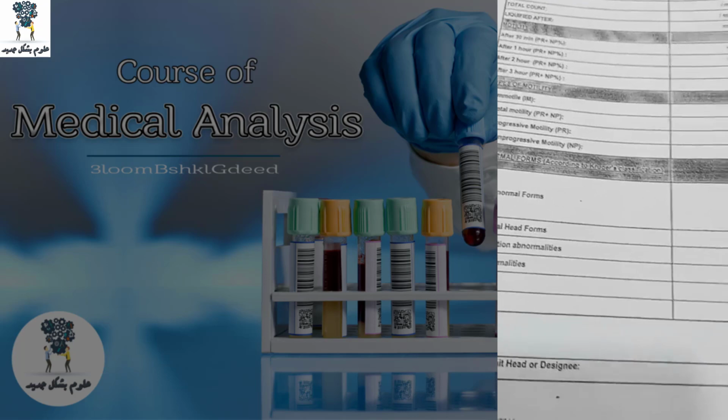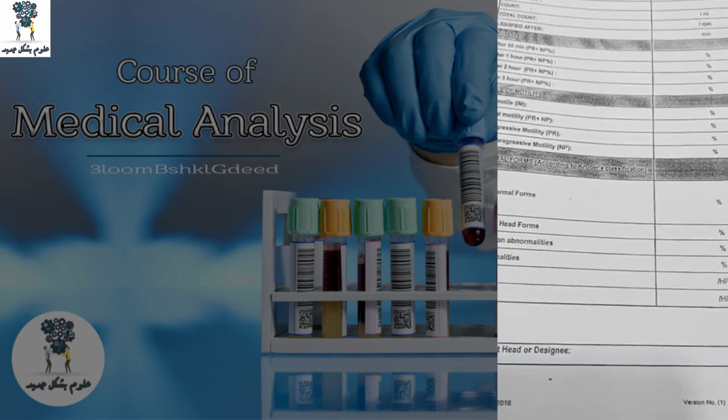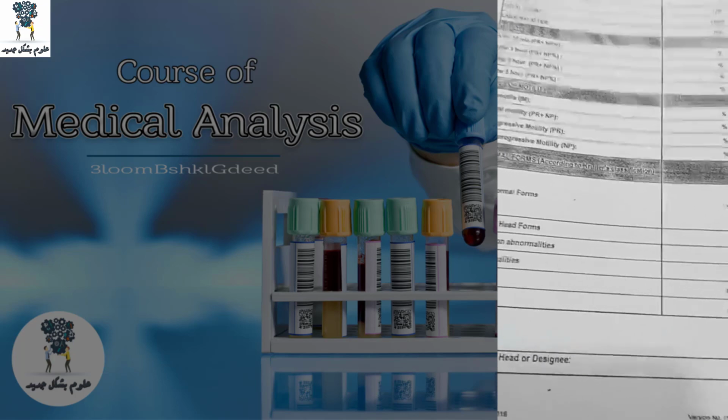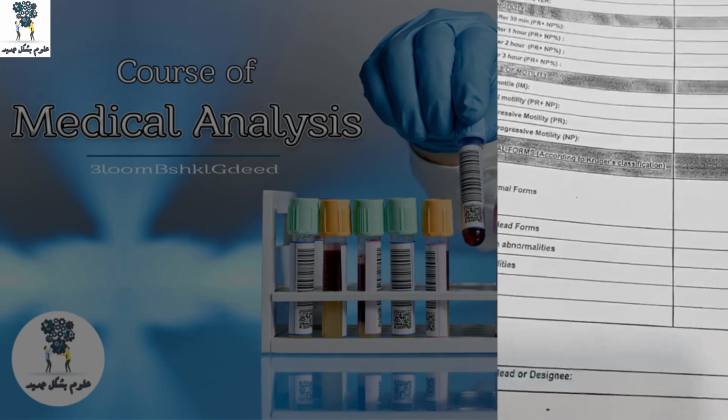واثنين وثلاثة. دي رقم 1. رقم 2 انا بعمل حاجة اسمها خطوة السنترفيجيشن بتاعت كل العينة لمدة ربع ساعة في تيوب معينة بتاعت السنترفيوج على سرعة 3000.